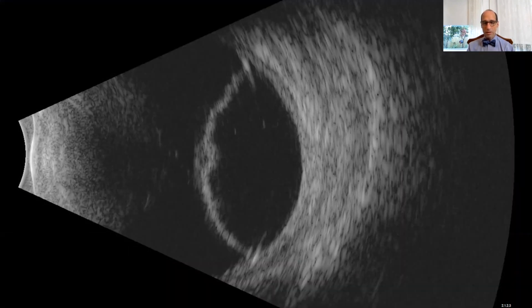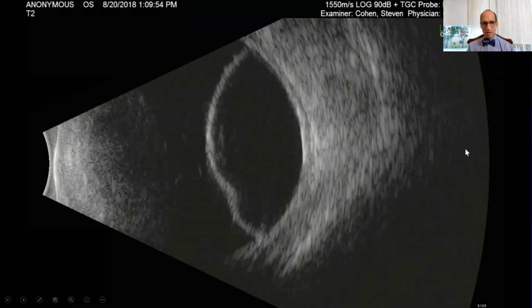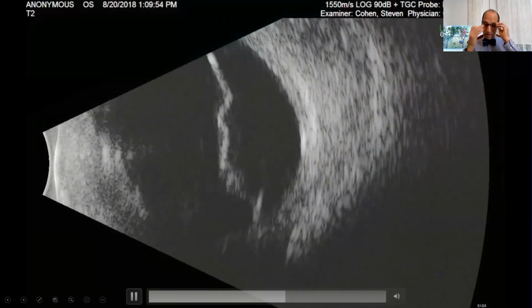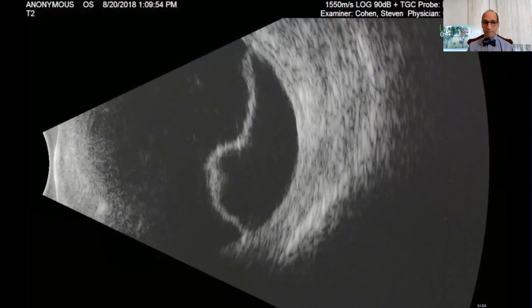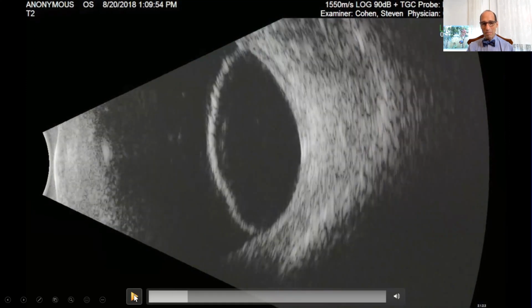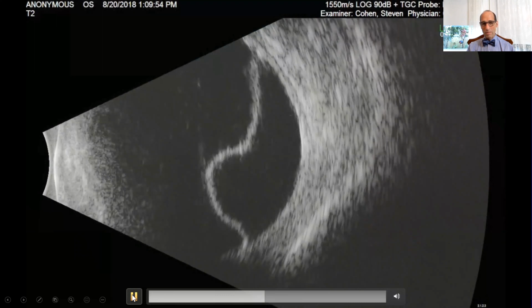You either take the person to surgery. This is another one, and you have to decide if that's a retinal detachment. And then here's the movie of the eye moving. So you'll notice these look different. This is a retinal detachment. So this one, you see how it's hyper-reflective the entire way. So you can't find a gap, unless you see the tear, which I think might be over here. But you can see it's super bright all the way across, almost as reflective as sclera.